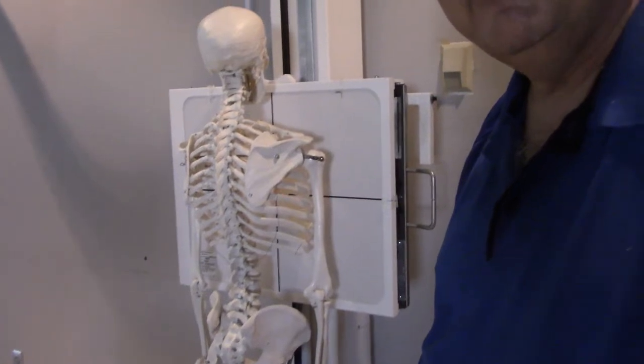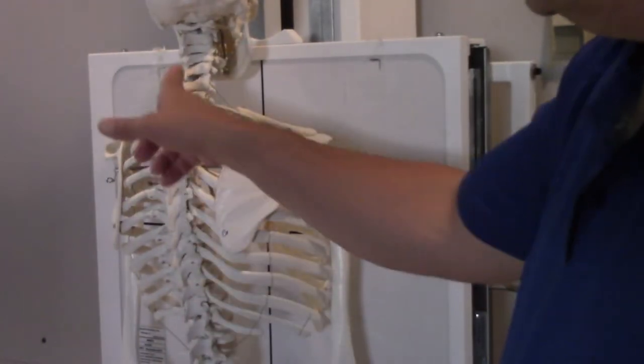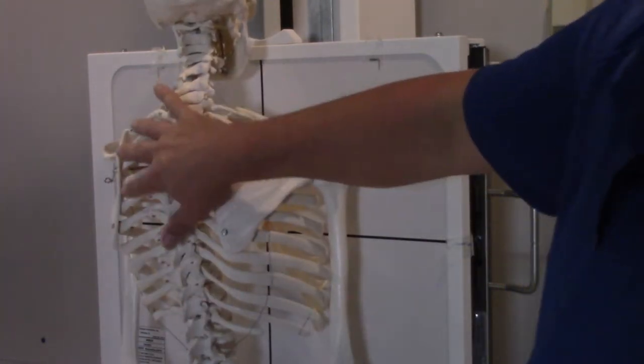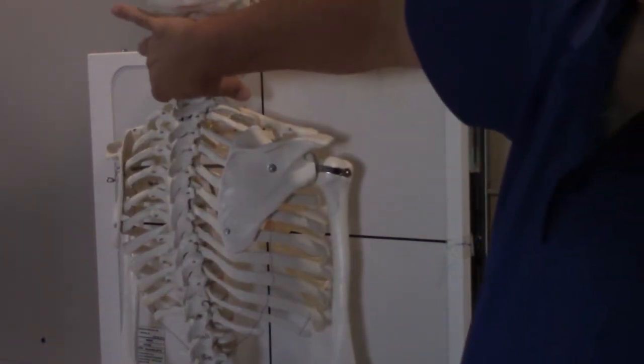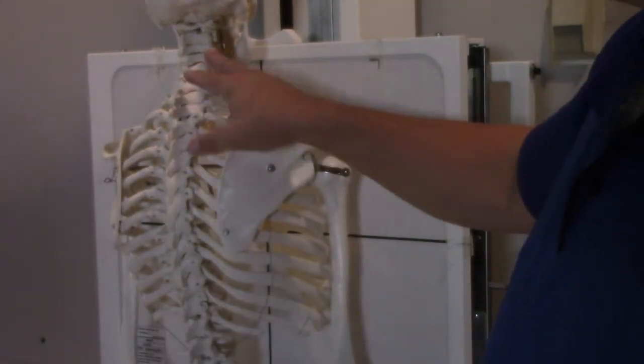Now, Boney over here is not an exact replica of a human being, but he does a pretty good job of illustrating this point. Unlike on a human patient, I can actually see Boney's bones. So if I'm wanting to line up on the mid-sagittal plane, it's pretty easy — all I've got to do is look for his posterior processes. On some patients it's kind of hard to landmark those because they've got a lot of fat back, but if you can't feel for any spinous processes, no issue — just look at the patient's neck and aim for the center of their neck, because their C-spine is in there and it's relatively centered to the tissue of the neck.